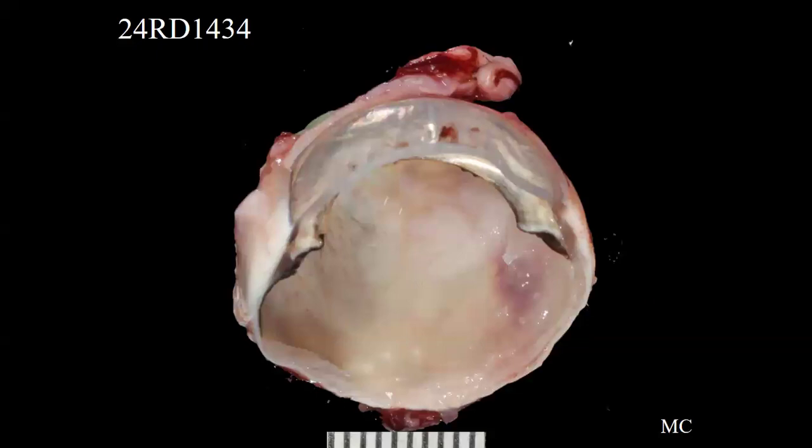So here's the next case. Sure this is the right paperwork. Okay. So this is a 15-year-old spayed female Siamese cat. The history is, let's see, retinal detachment with superior temporal retina appearing attached with granuloma temporal to ONH within visual streak. There's multifocal fluffy white intraretinal patches, and the fluid under retina is not clear. So presumably kind of a cloudy fluid subretinally.